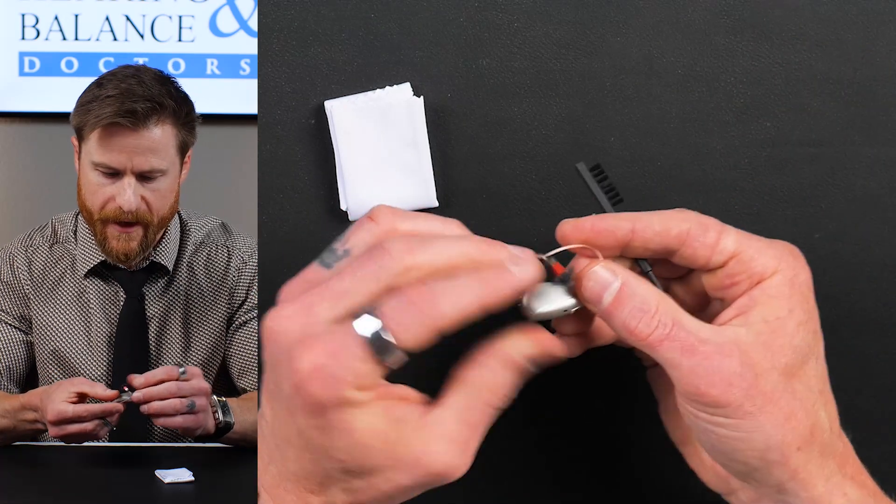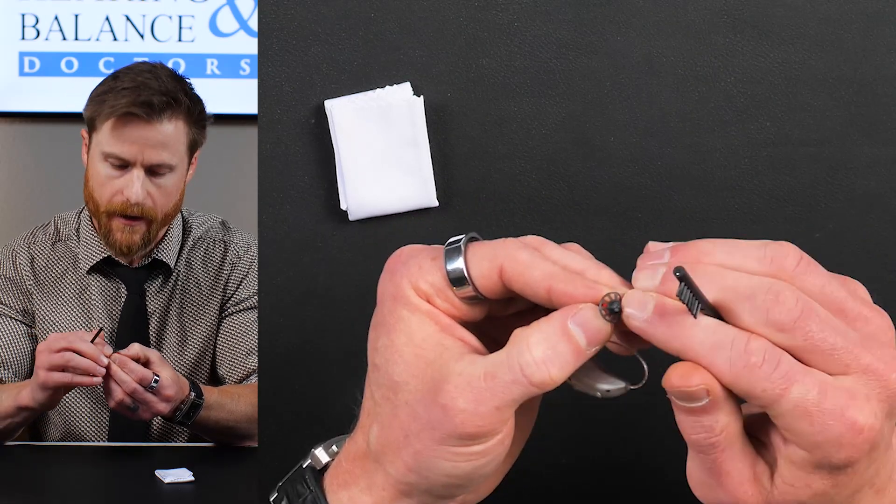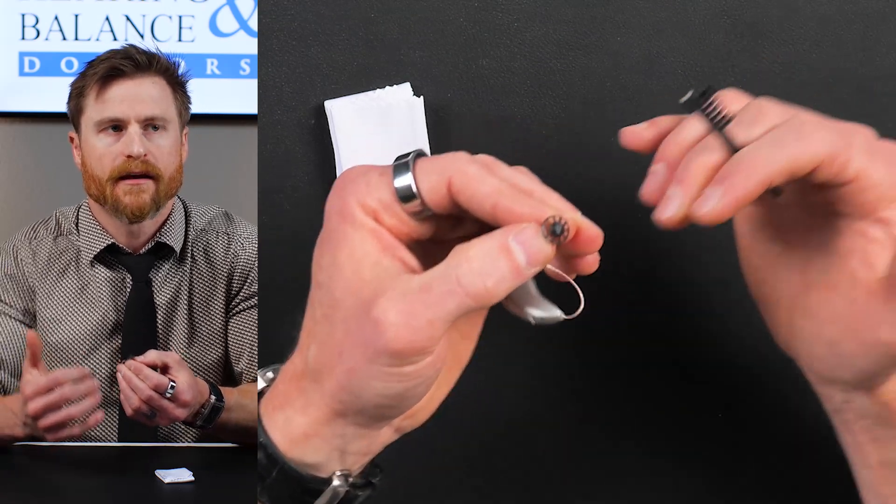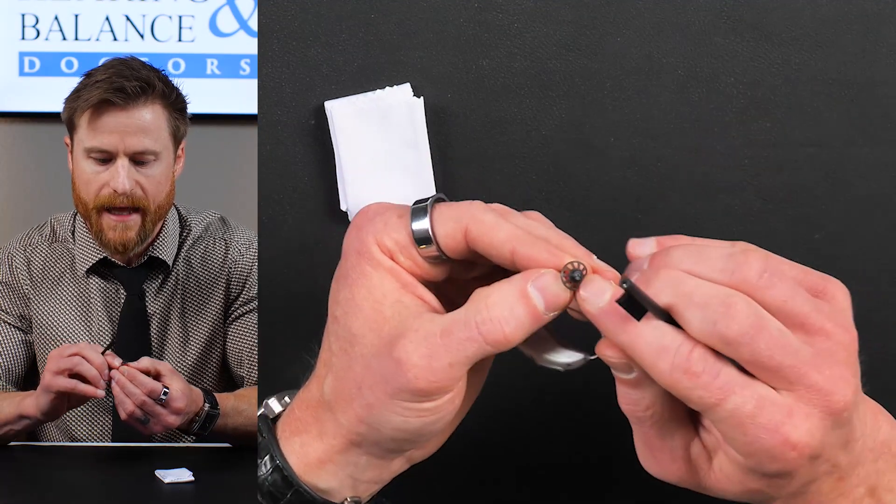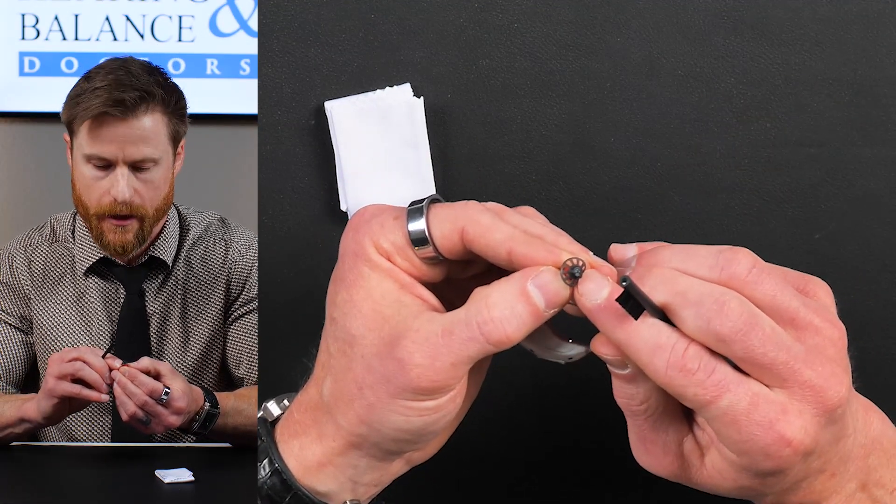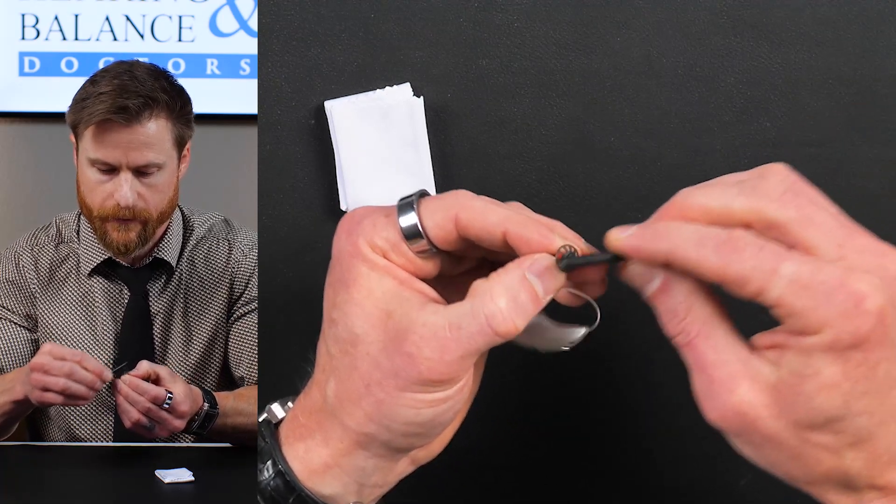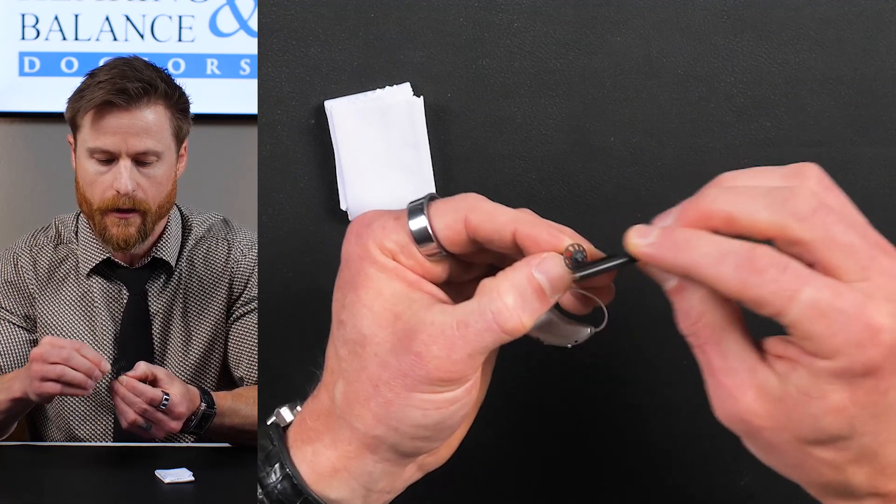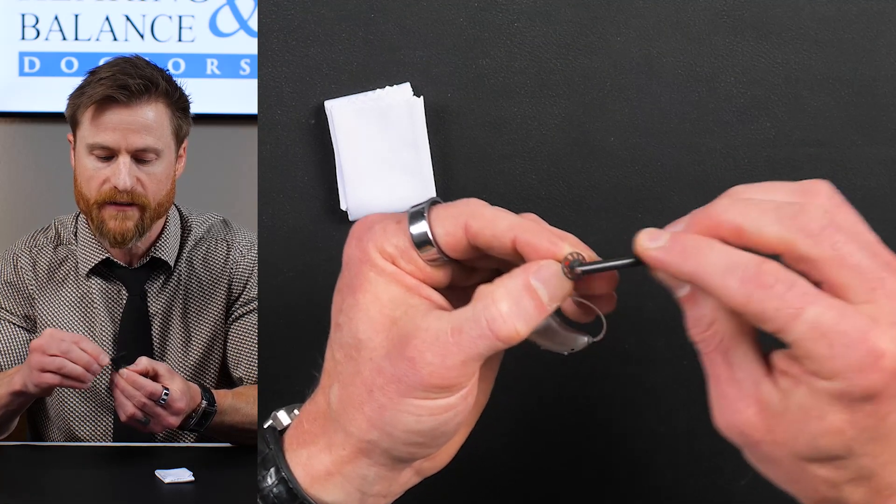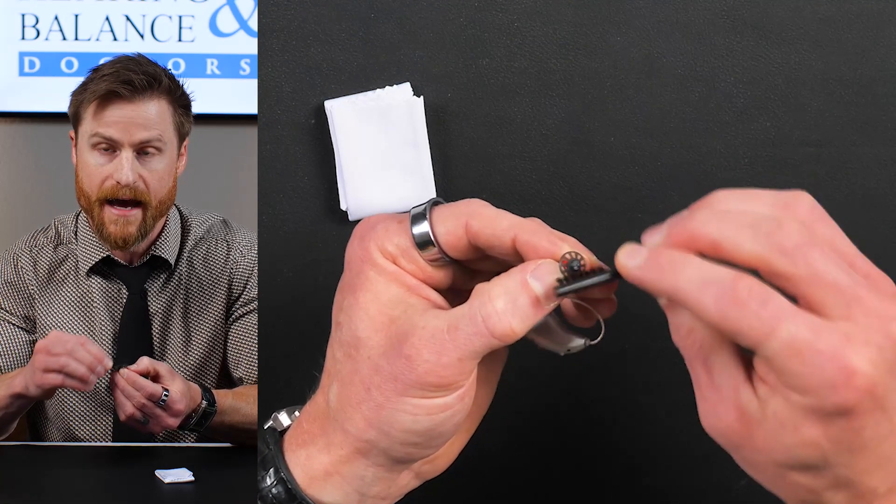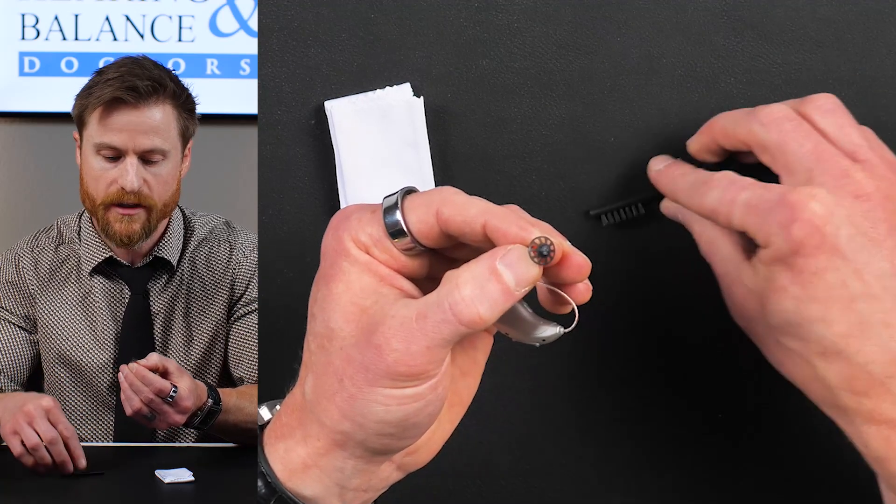After that, then you want to brush the dome. Wax can get clogged up in this dome. If you're lucky enough to have the thin, runny, soupy, goopy wax, then that's more likely to plug this filter up in this dome. So first step, let's clean the dome. So again, in the morning, why are we doing this in the morning? Because any wax left over from the previous day is dry by that point. So now it's just flaking right off. Perfect. Dome is clean.